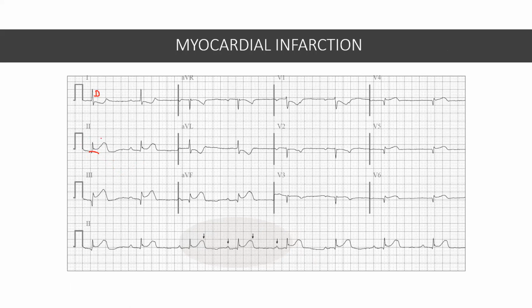It's elevated, and a lot of you measured it already by 2 millimeters. So that's okay for now. How about lead 3? It's elevated. Very good.